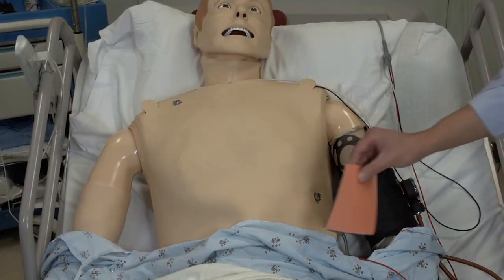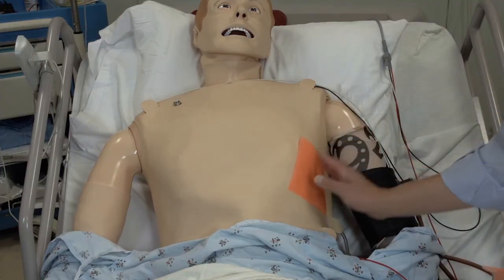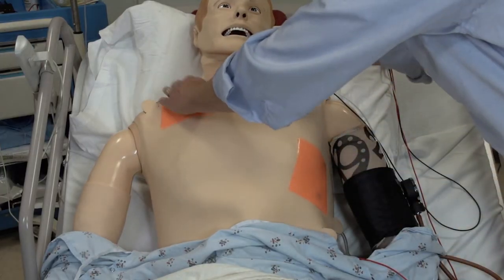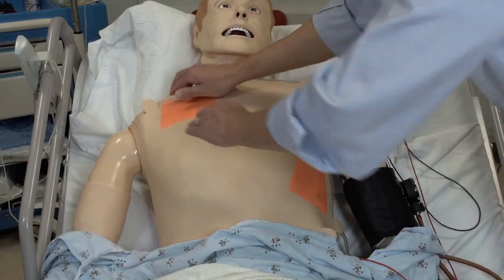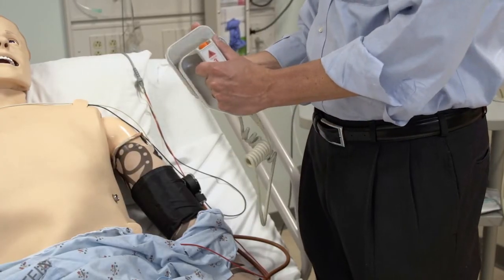If using a manual defibrillator with paddles, you must place conducting material between the paddles and the chest to avoid skin burns. Use either a conducting gel sheet or liquid gel that you place on the paddles.